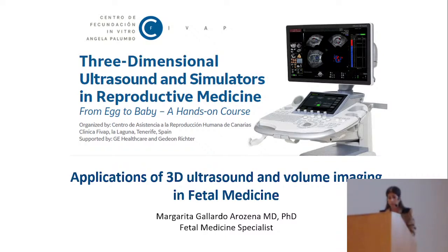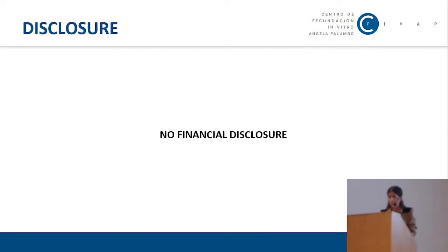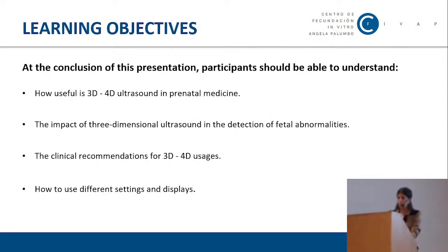There is no financial disclosure, and at the conclusion of this presentation, all of you should be able to understand how useful is 3D and 4D ultrasound in prenatal medicine, the impact of three-dimensional ultrasound in the detection of fetal abnormality, clinical recommendations for 3D and 4D usages, and how to use different settings and displays.